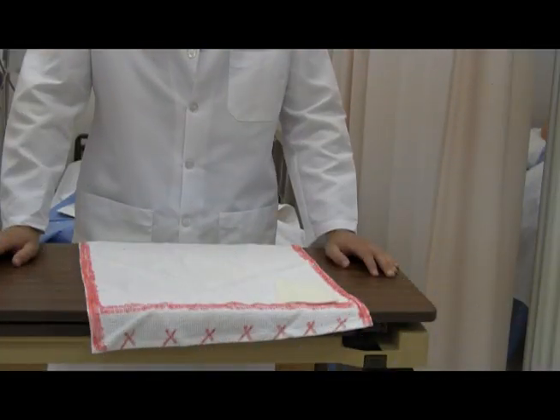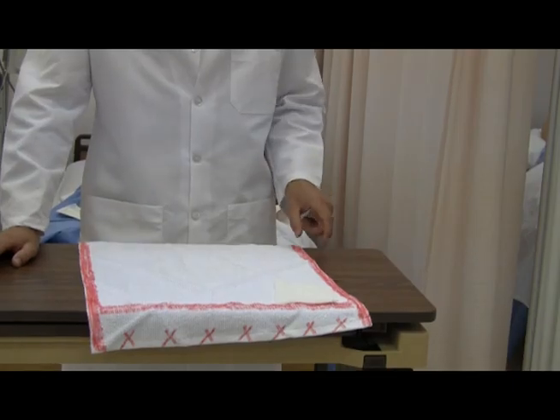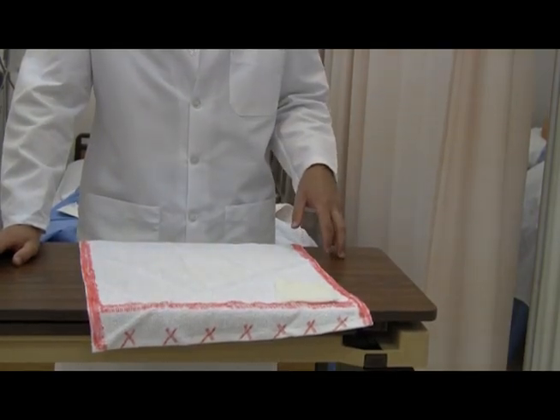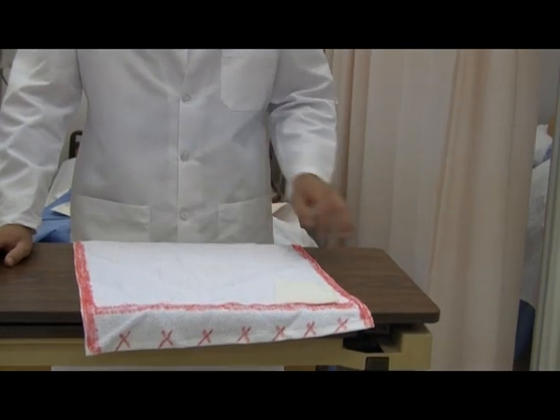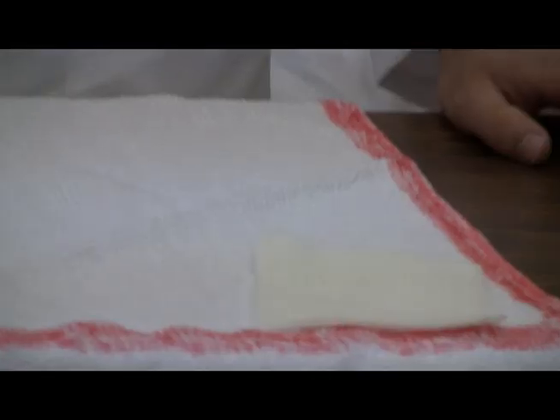We're going to switch back to color real quick to demonstrate the concept of the sterile field and the contaminated area. Anything hanging off the table is considered contaminated, and there's also a 1-inch border demonstrated by the red that is considered contaminated. So in this case, your 4x4 is contaminated and you can't use it.